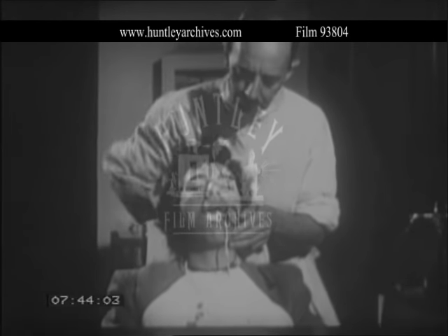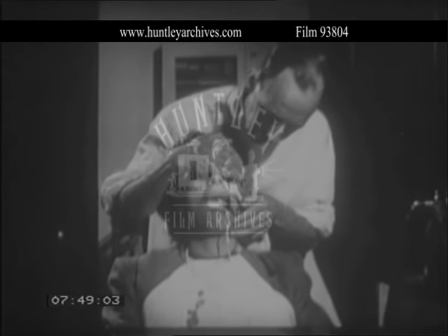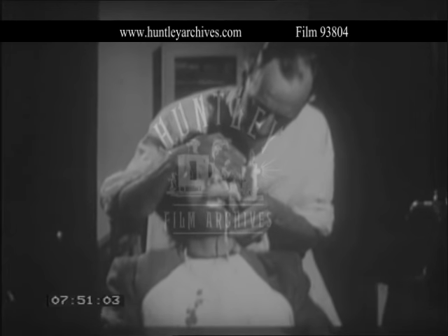Allow the patient to recover consciousness with the spoken word as the only stimulus. Cover the eyes from the light and tell her quietly where she is and that the extractions are over. Delay the removal of the throat pack and dental prop until full consciousness is reached, as the manipulations may be misinterpreted as the finish of the extraction.